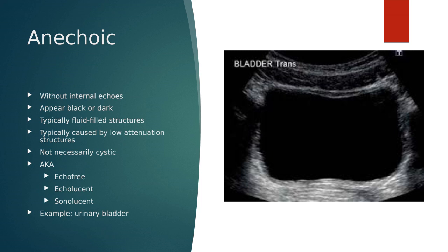As sound travels through the body, it slowly loses its energy, right? So think about when you're running a race. You typically have a lot of energy right when they say go. By the time you get 1 lap in, 2 laps in, you're slowly losing steam. That's going to be the same thing for our sound waves. Right when they come out of the transducer, right when they enter the body, they're going to be the strongest.